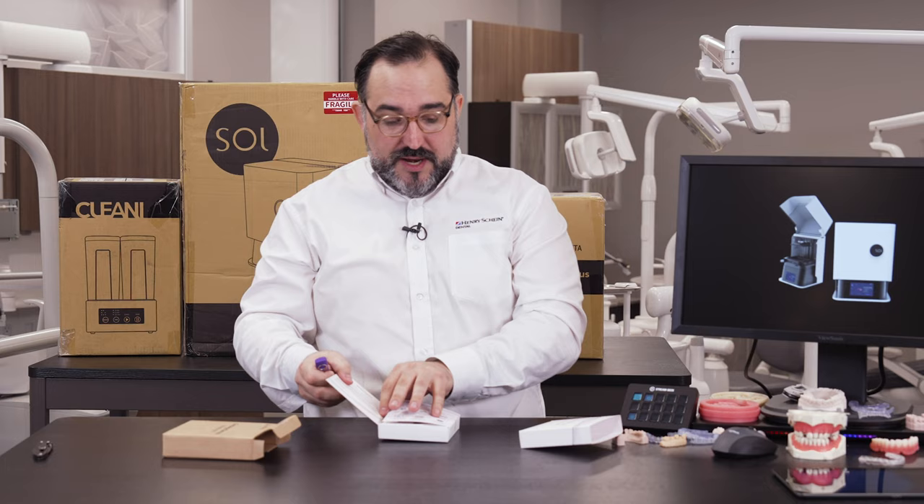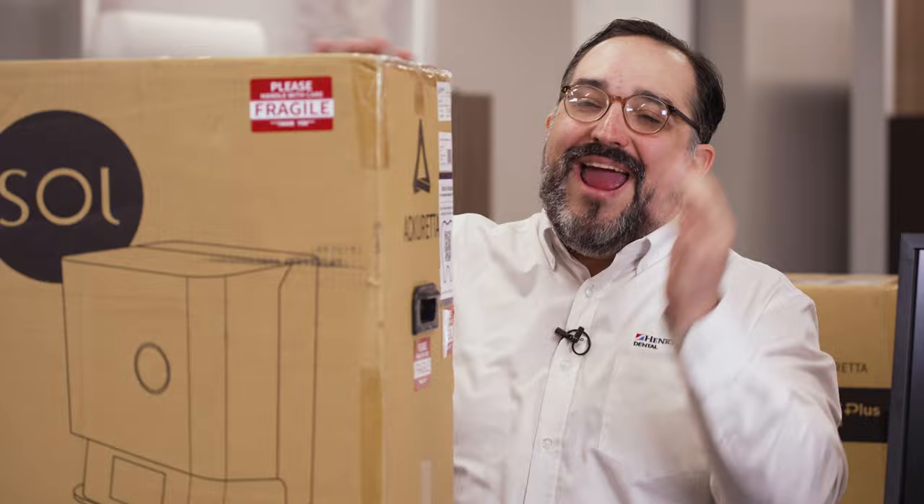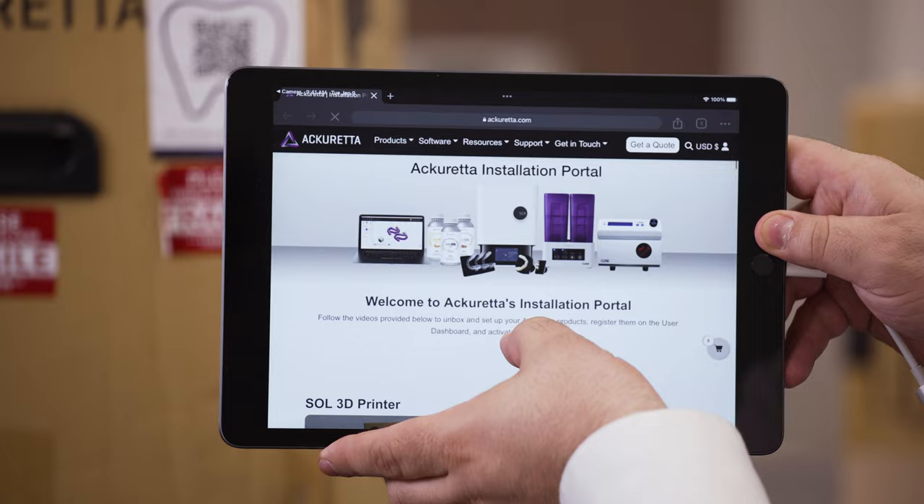A cool thing about the box before we even open it — there's a QR code which brings us to the Acureta installation portal with a bunch of really great videos on how to get everything set up. So let's crack this open and get into it.